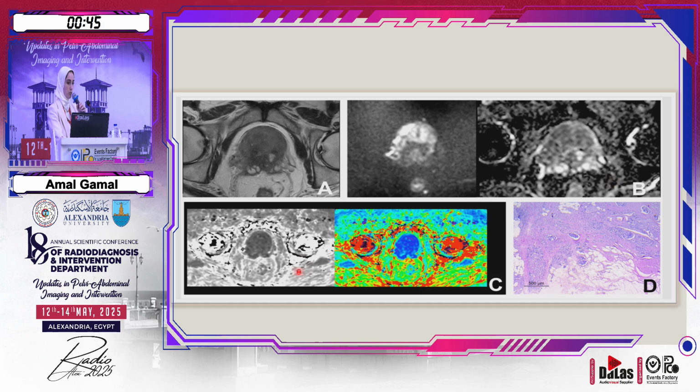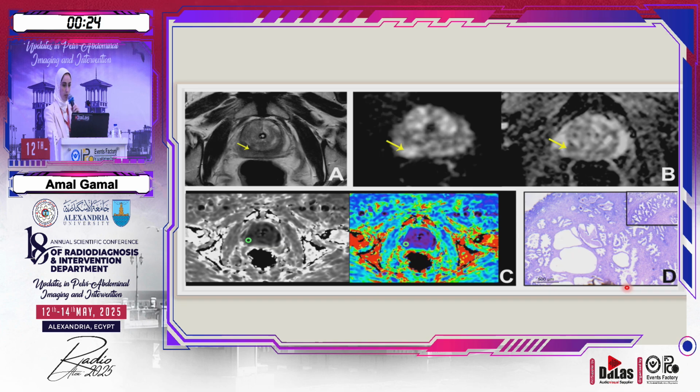This is the T2 star and R2 star colored map. The value of the R2 star was 34. And this lesion was proved by histopathology to be adenocarcinoma, Gleason score 5+5, grade group 5, with extraprostatic fat invasion shown here. This is another example from our work.